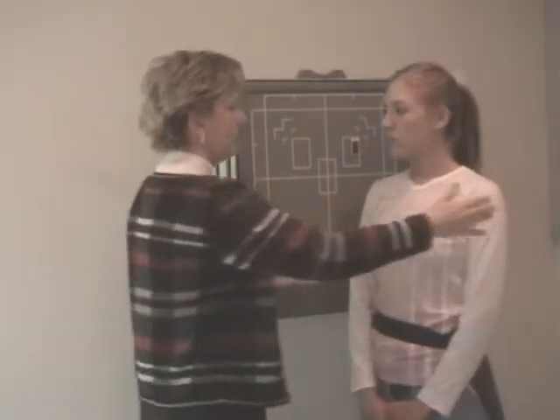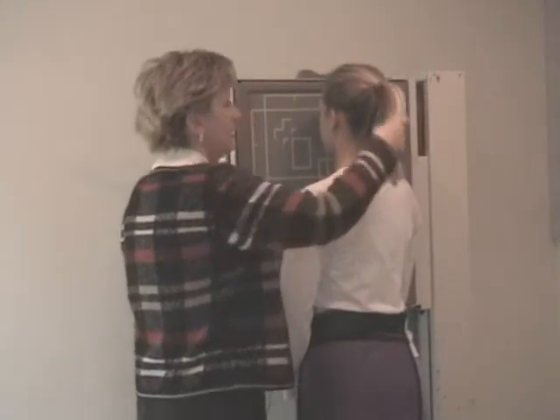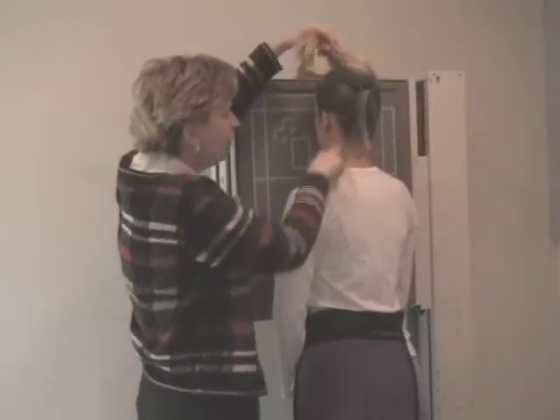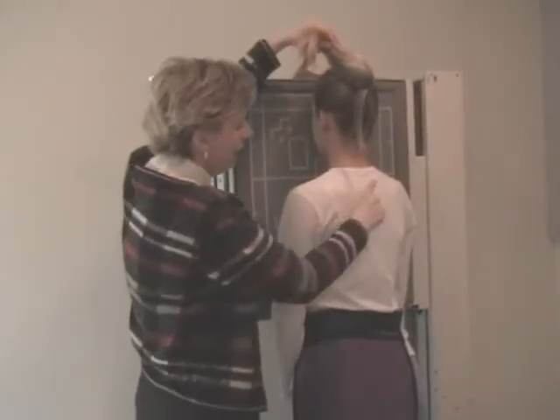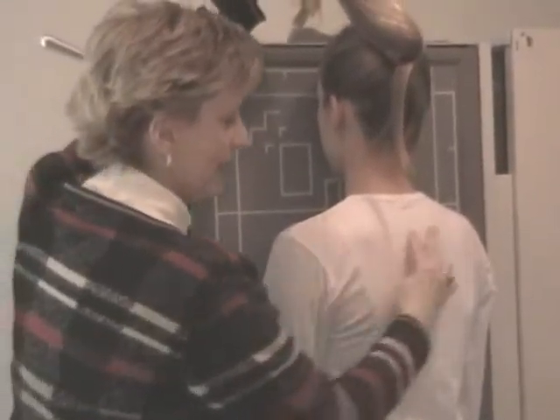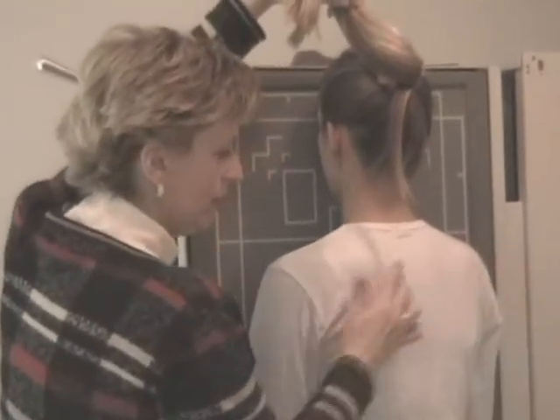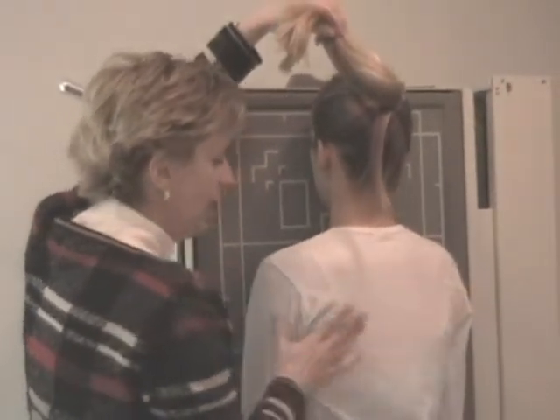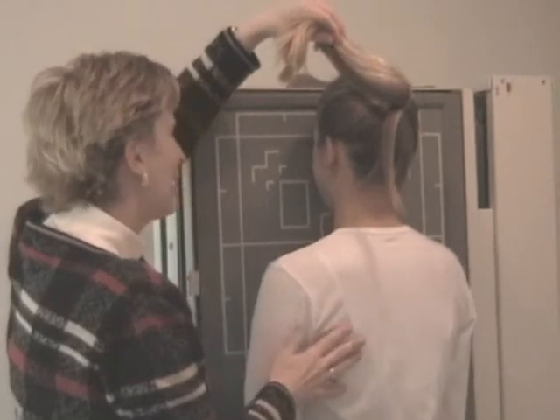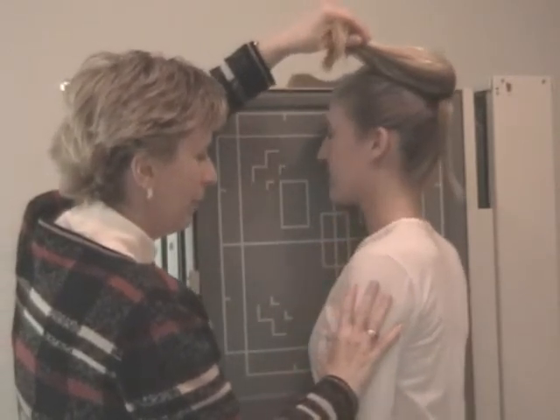Now, it really helps to see the body here, Kristen. If the intervertebral foramina are not opened on your X-ray image, and you see a lot of the lungs, and the ribs are laid out, and you see clavicles laid out, see Kristen's body, you're going to see lots of clavicles. That means the patient wasn't obliqued enough. You need to oblique her more.